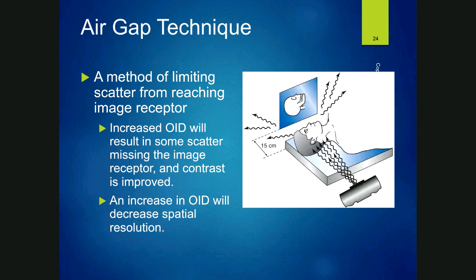So you might see them. I like to give the example when you do a lateral lumbar spine and you have collimated it in, but you still see an outline of the patient's body outside of your collimation. Again, this is hard to demonstrate without a picture up here or my hands to show you or a crappy drawing on the whiteboard. But whenever you have collimated down to the spine, but you can still see the outline of their belly, their behind, their soft tissue, those are the effects of scatter.